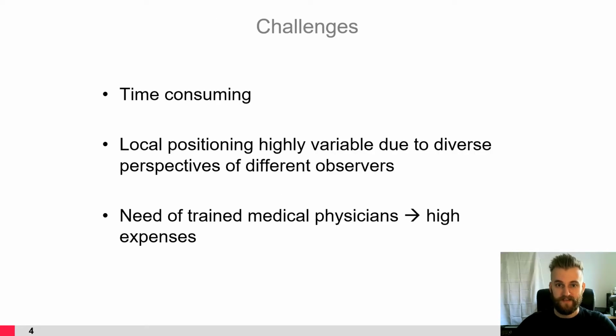One of the challenges here is that landmarking is a time-consuming task, which is generally done by hand, step by step, so each landmark has to be placed individually. This procedure leads to another problem. The local positioning of landmarks is highly variable due to the diverse perspectives of different observers. This means there is no guarantee that one point in the eyes of one physician is in the exact same spot as another physician would see it. And of course, the last challenge here is that to properly set landmarks for many scans, there is a need for trained medical physicians, which is always related with high expenses.